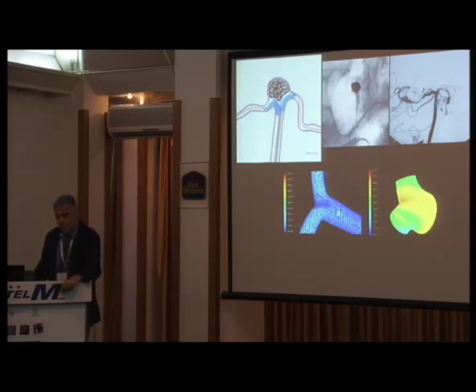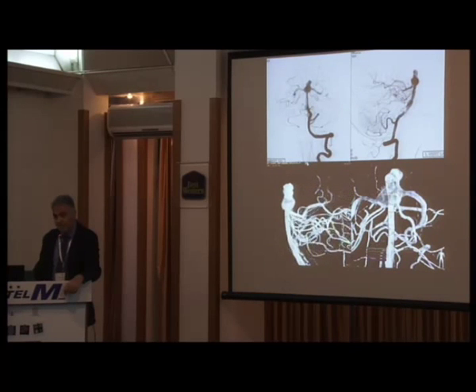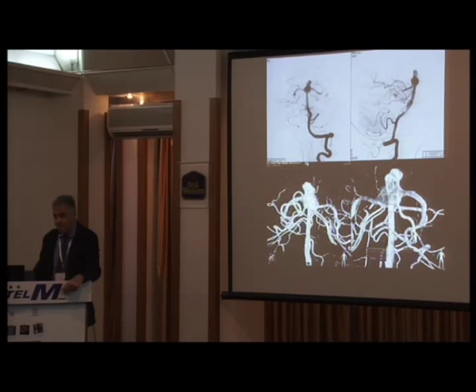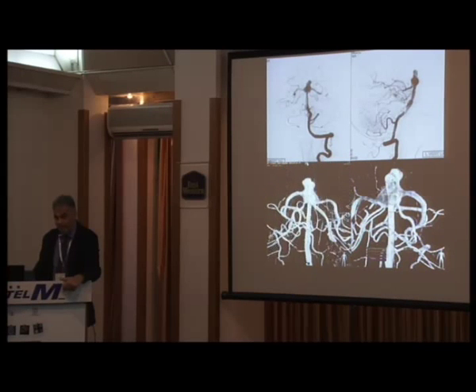And then we started to create a nose of the coils with our improving techniques, like this biballoon technique, like a ship nose or like legs of a bridge to divide the flow. But even in that position, we didn't change the pressure on the bifurcation much. How can you treat this bifurcation aneurysm by coil? Because all the basilar tip is diseased and all arteries come off from the aneurysm.